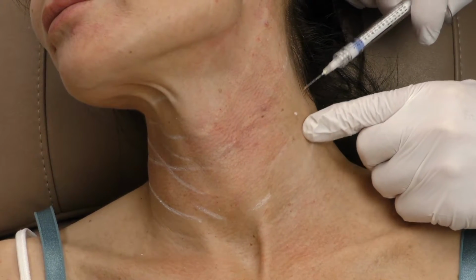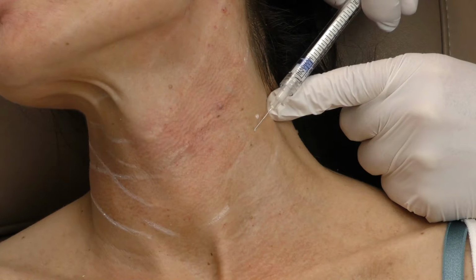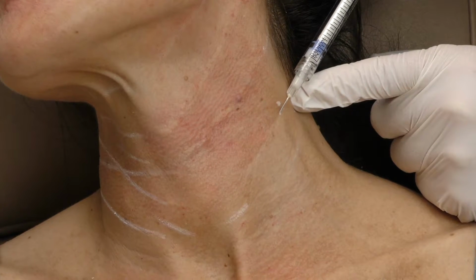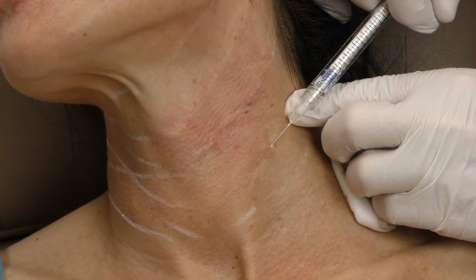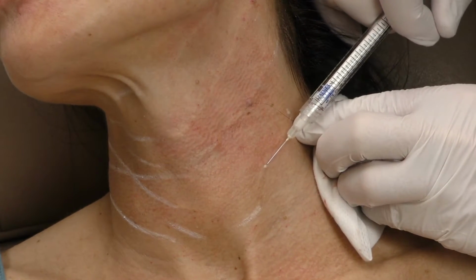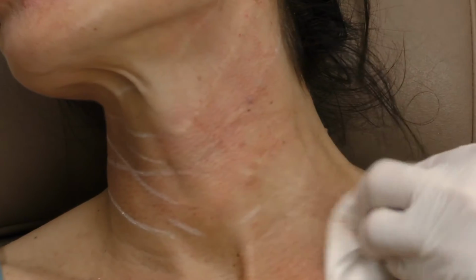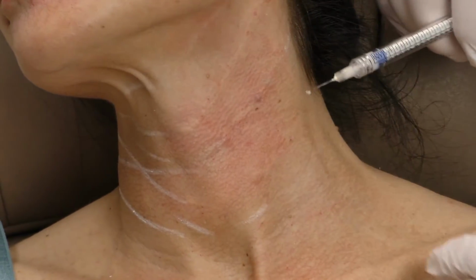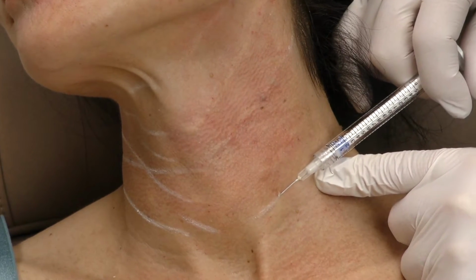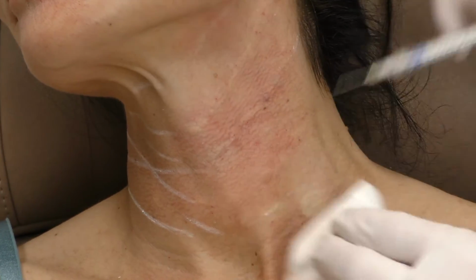So you see here this entry point. Let's see. I go in with the needle quite horizontally. I advance. So the risk of actually getting into the carotid artery is extremely low. Of course, we have to be aware of the carotid arteries, especially internal, because that has a direct connection to the brain, and we don't want to be injecting this product into the brain, of course. So we have to make sure that we stay just at the dermal-subdermal junction. All right.